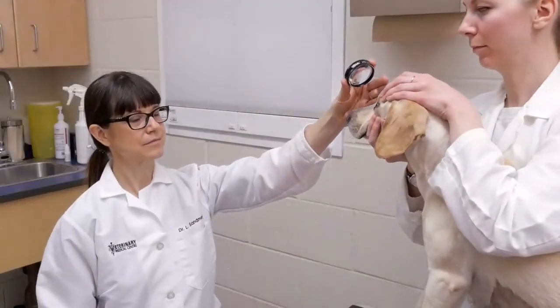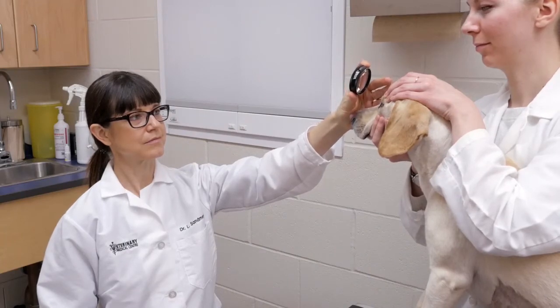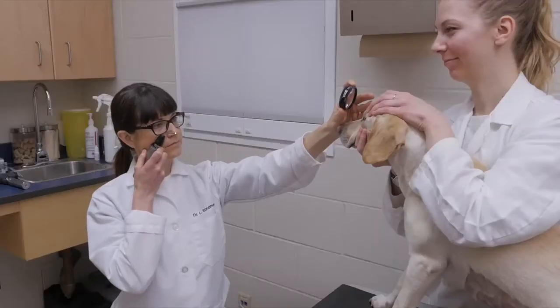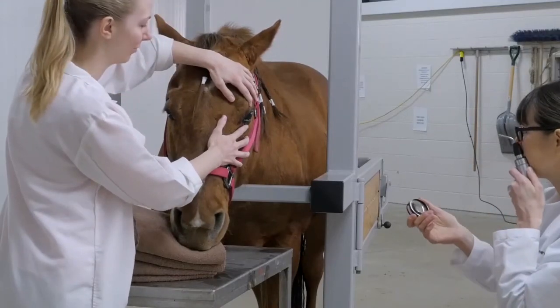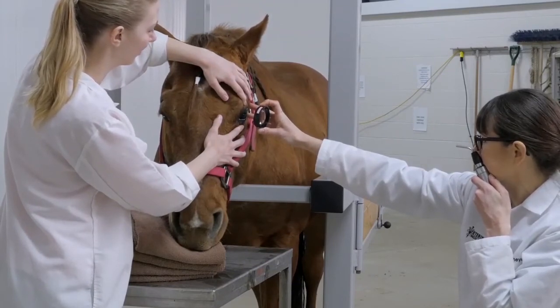Small animals should always be examined on the table in a sitting or sternal position. This allows the examiner to position him or herself comfortably at eye level or even slightly lower than the patient. This positioning is essential to obtain the tapetal reflection required to initiate fundic examination. A chair at the head of the examination table may be necessary to allow for such positioning. Large animals should be positioned such that the head is at eye level of the examiner. This may require an assistant to elevate the head in the sedated animal.